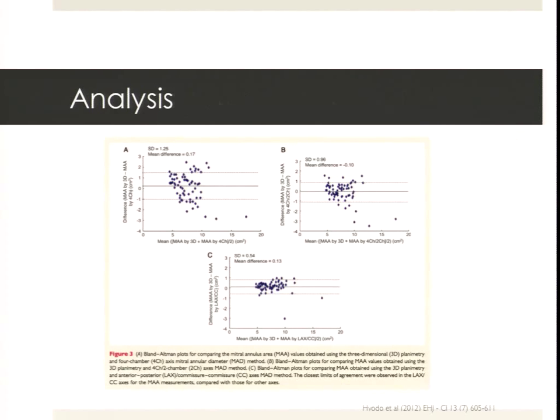That said, generally, you're not pinning that much on that measurement. You're trying to get an idea of the relative contributions of annular dilatation. Now, we used to believe that all annular dilatation was from the posterior side, or stretched out, but that's been a bit debunked. So getting a real appreciation of what goes on. But generally, you're trying to give the surgeon an idea of what they need to do to restore the annulus with what ring. And I'll address that in a moment.